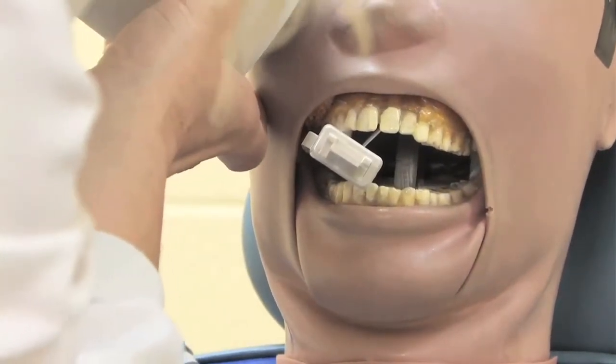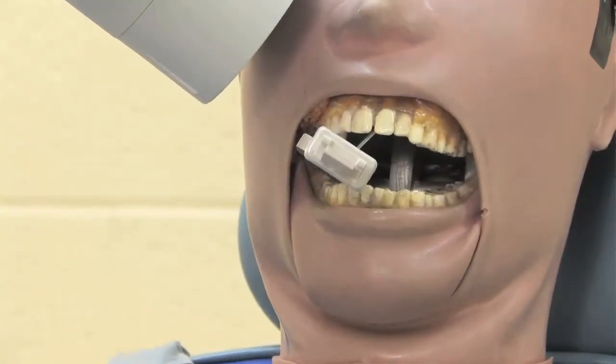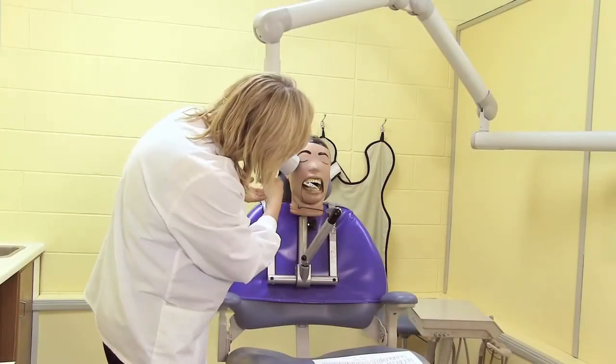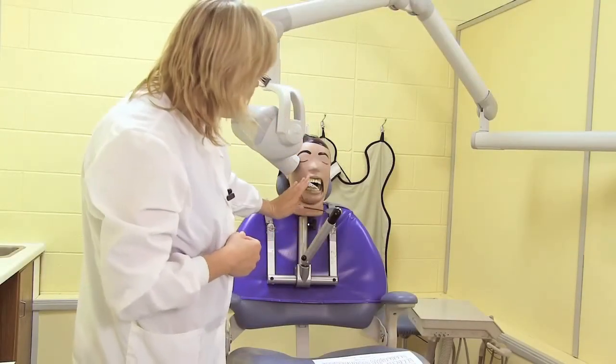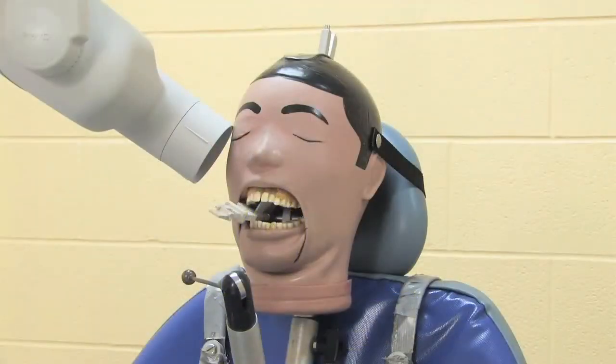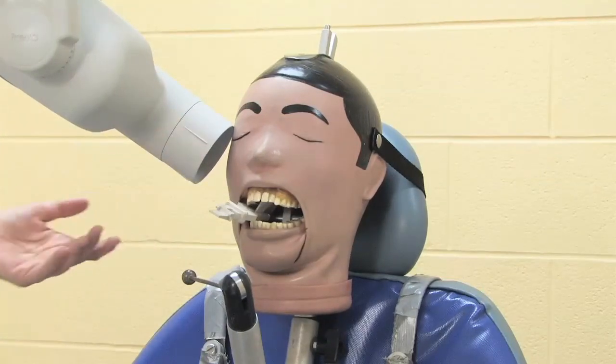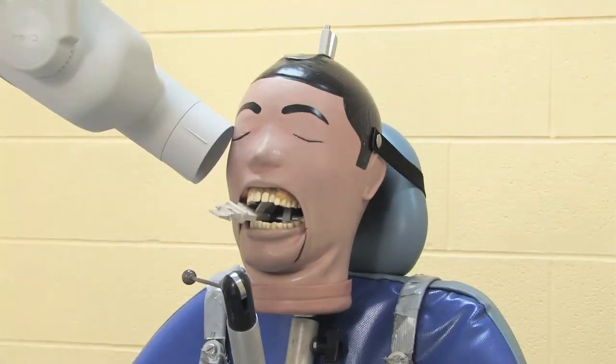I'm lining up my PID so that I see that it's as parallel to the tooth as possible, or the film as parallel to the PID as possible. And really we're looking at a full parallel plane from PID to tooth to film. Then I'll again refer to my notes, which tell me the angulation for the maxillary molars should be about 15 degrees. That would be the same for the left side.